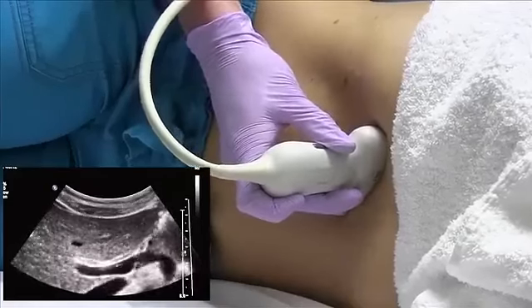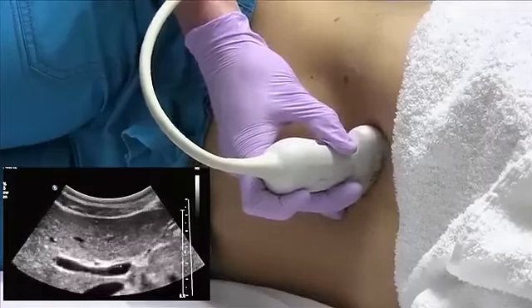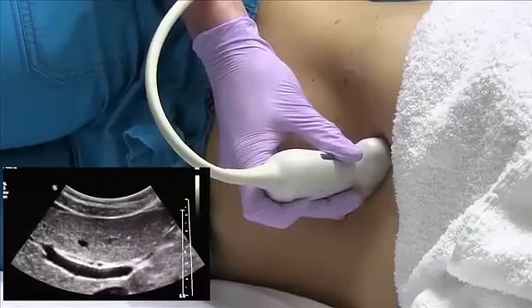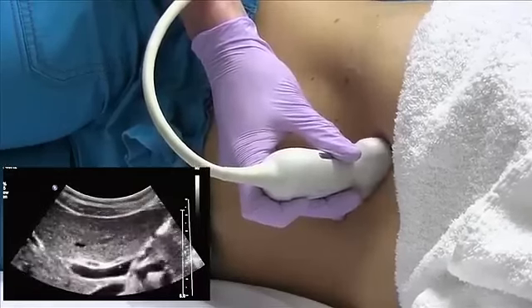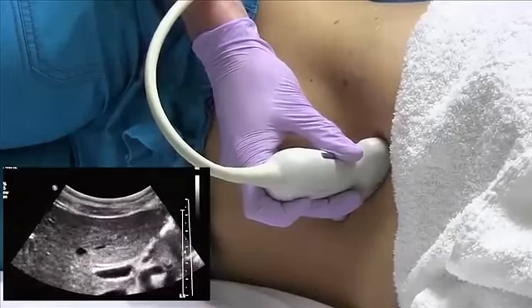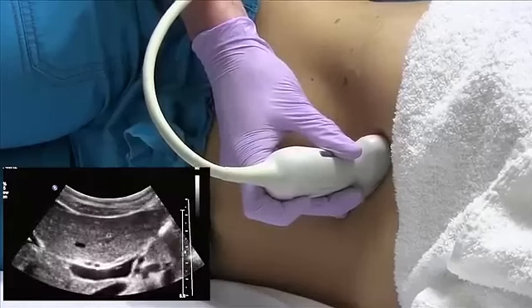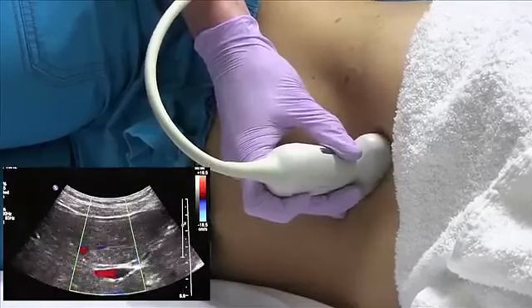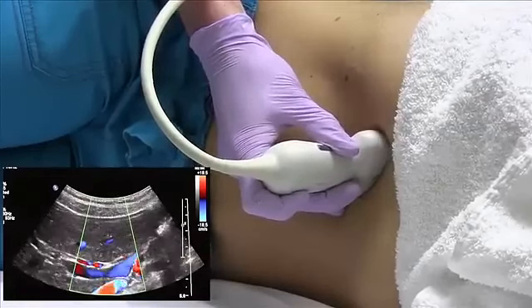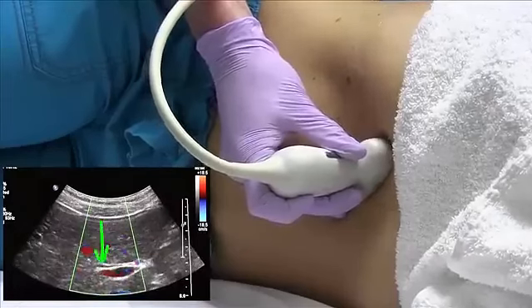So you keep tweaking the probe until you elongate one of these tubular structures next to the main portal vein. The easiest way to see if you're on the hepatic artery or the CBD is to turn on color and see if it lights up. If it lights up, you are on the hepatic artery, and if it doesn't, you know that's the CBD.